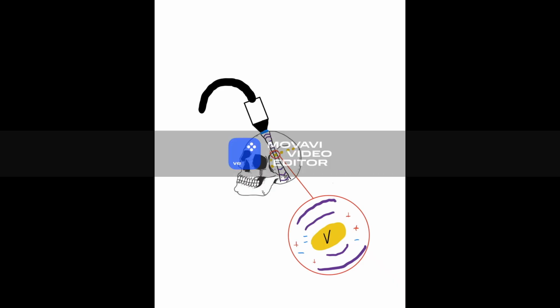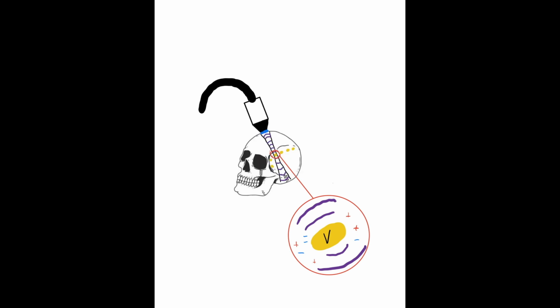Ultrasound vibrational potential imaging offers a modality that is low cost, safe to use, and can be used during or after a procedure. For example, by placing an ultrasound transducer against the patient's skull, ultrasound can be pulsed to the skull in order to oscillate ions surrounding the electrodes in the array. This creates a voltage potential that can be measured from the electrodes themselves.